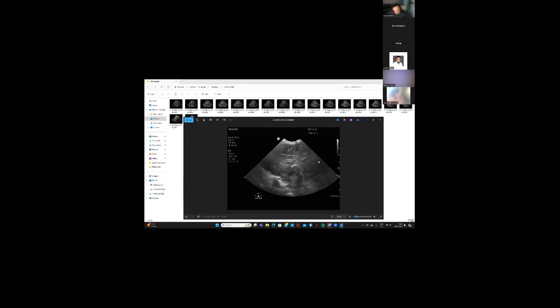Now starting the sagittal. This is the mid sagittal. Here we can see that guitar-like structure, which is your corpus callosum. This is that little bit of ventricle. Then the choroid at the back, extending down towards the cerebellum, and in front the fourth ventricle.